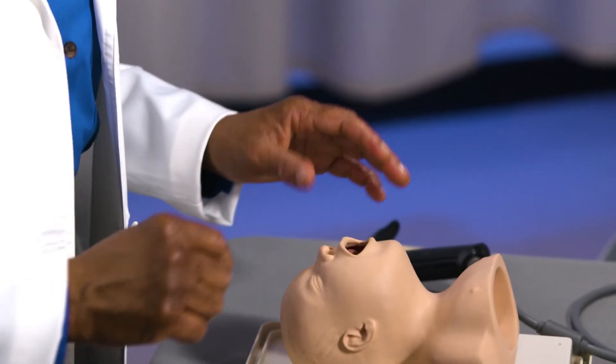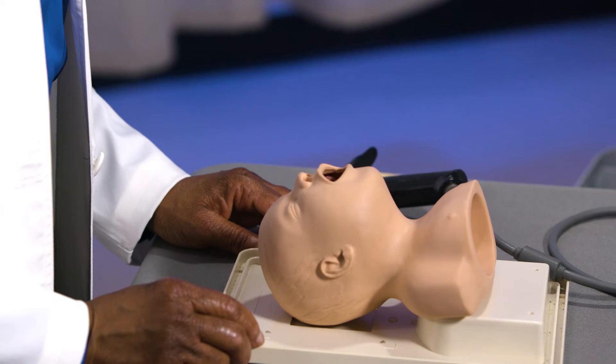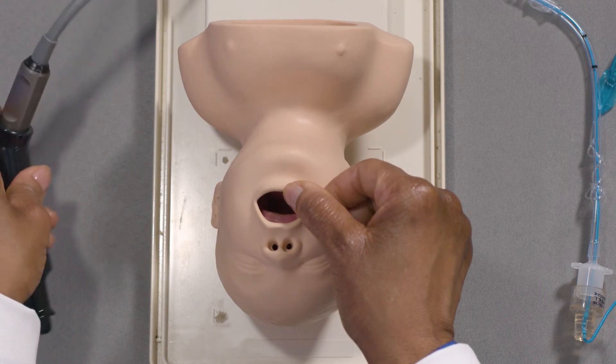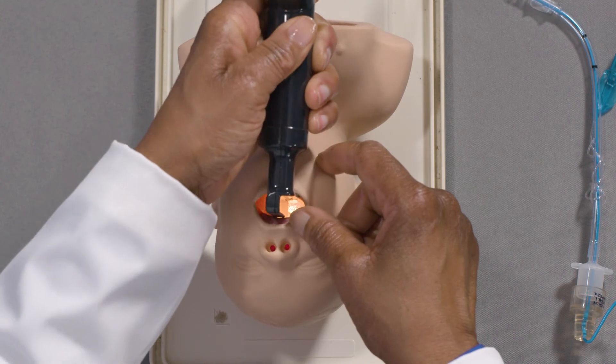Position the patient in the sniffing position to align the three axes per standard practice. In this first step, looking at the patient, scissor the mouth and insert the blade on the right side and sweep the tongue to the left as you advance the blade.